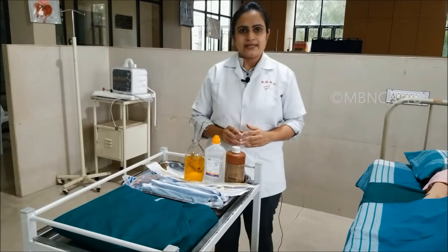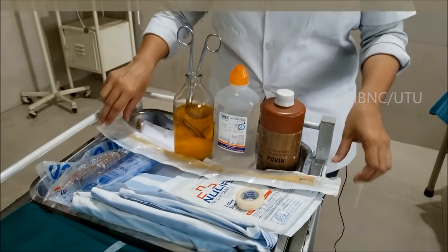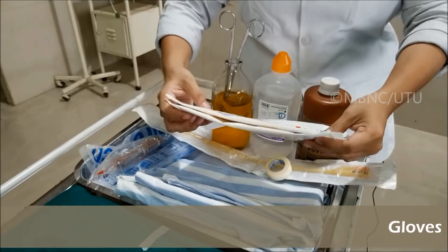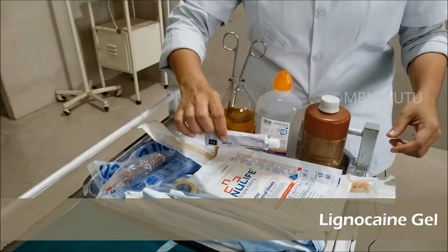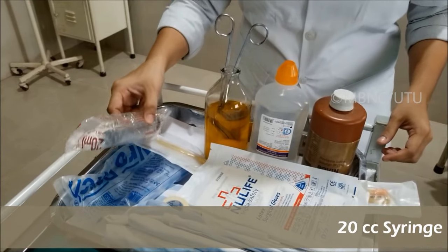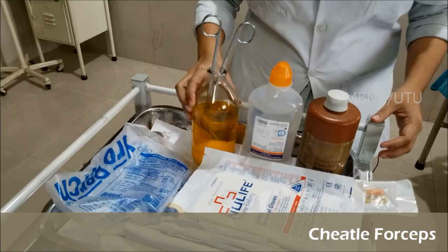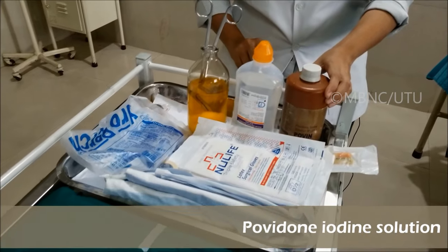Articles required for the procedure: one clean tray and one sterile tray. The clean tray contains an appropriately sized Foley catheter, two pairs of gloves to maintain aseptic technique, one adhesive tape to fix the catheter, lignocaine jelly to lubricate the catheter, a top sheet to drape the patient, a 20 cc syringe to inflate the balloon, a urobag to collect urine, sponge holding forceps with antiseptic solution, normal saline to inflate the balloon, and iodine solution to clean the genital area.